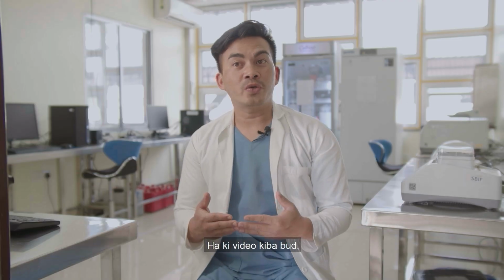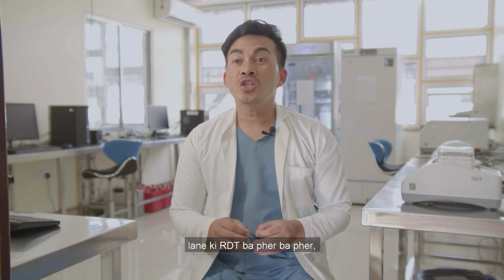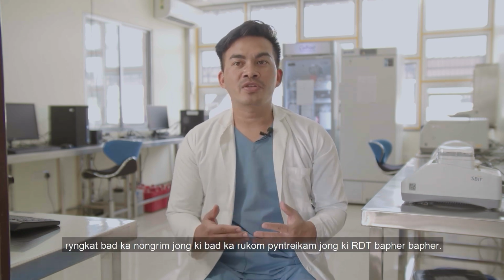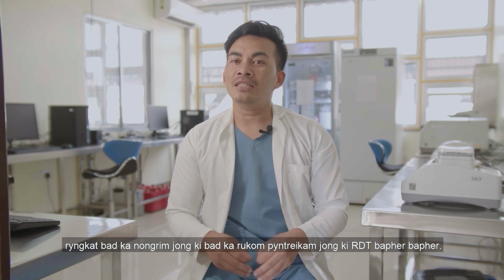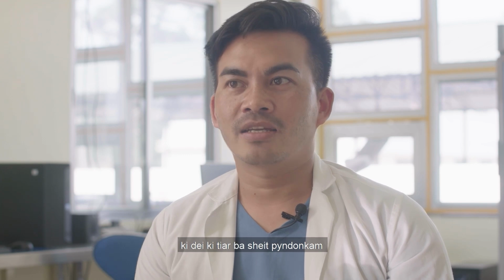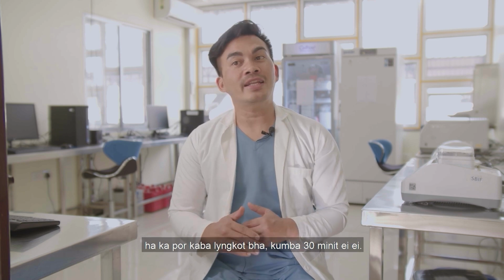In the following videos, we'll be learning about the different types of rapid diagnostic tests, also commonly known by the shortened name RDTs, their basic principle, method of use and sorting the kits. Rapid diagnostic tests are, as the name suggests, kits that are used for diagnosing infections or diseases within a short time period, usually within 30 minutes.